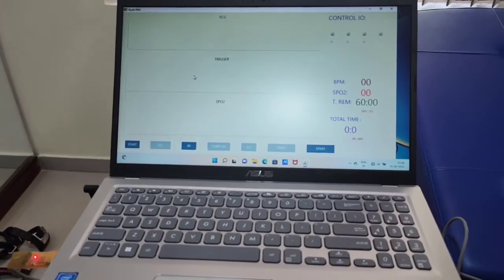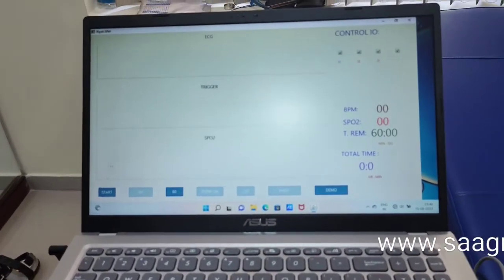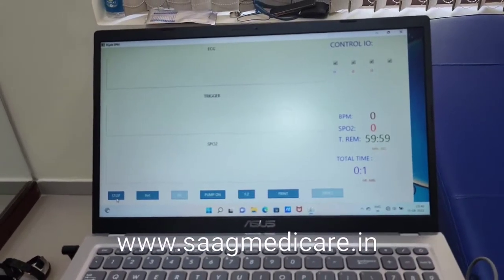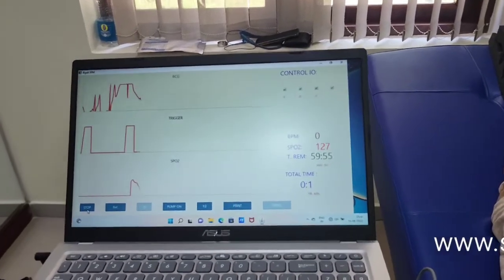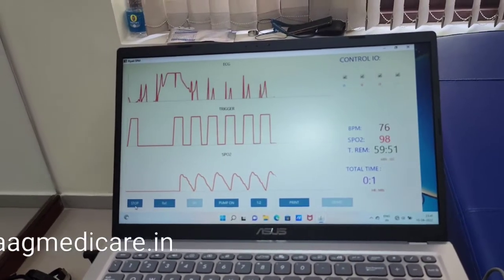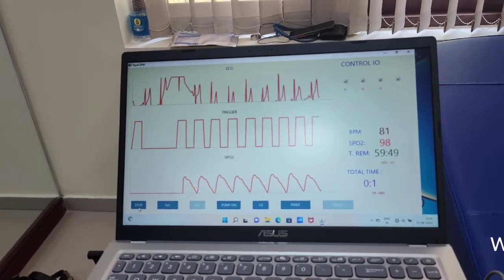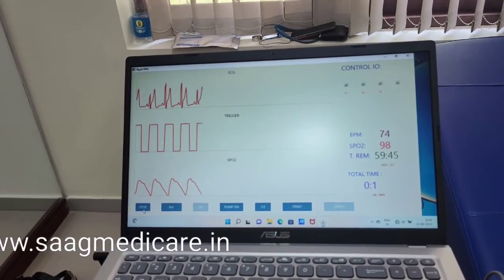Going to the machine, this is the interface here. We can start the procedure by pressing the start button, waiting for a while. Here is the ECG waveform.